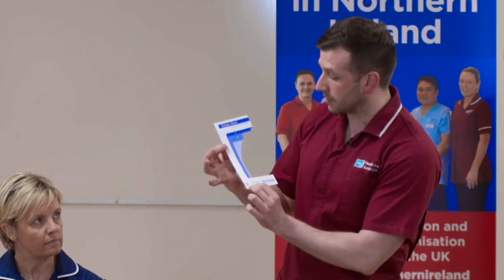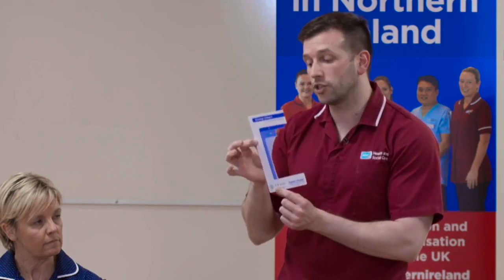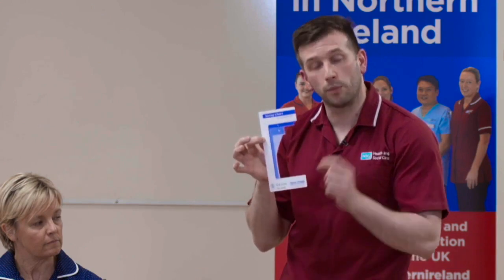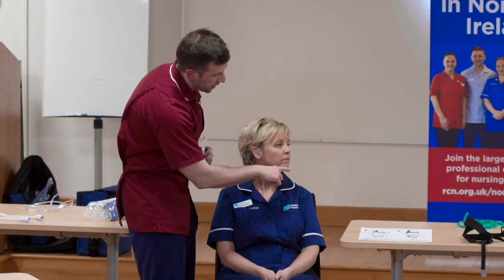Within most of the interfaces that you'll be dealing with, you will see sizing charts. I'm using a sizing chart here from Fisher & Paykel Healthcare. The sizing chart helps you to identify the appropriate size for your patient. How you're looking to measure is you're looking to measure from the nasal bridge just to the chin, or just the cleft of the chin, or the space between the lower lip and the chin.